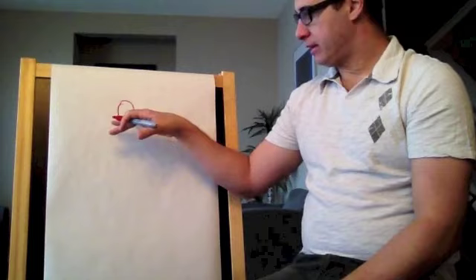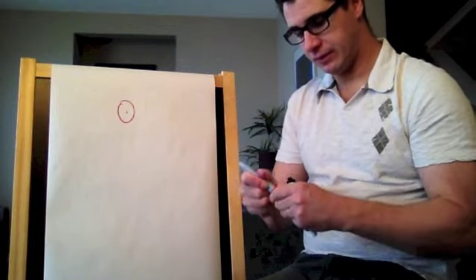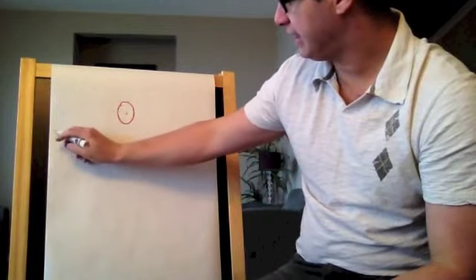Is that this is the lead. So when the electricity is going towards the lead, it will be in a positive deflection. That means that if the electricity is coming to me, that's positive, and on my ECG the tracing will be positive. If the electricity is going away from the lead, it will be negative. And this is the same concept for all leads.